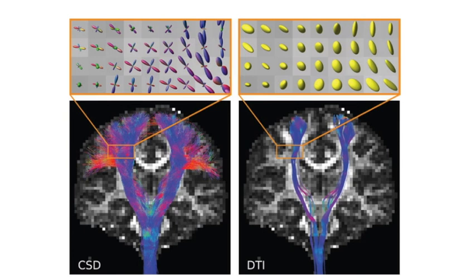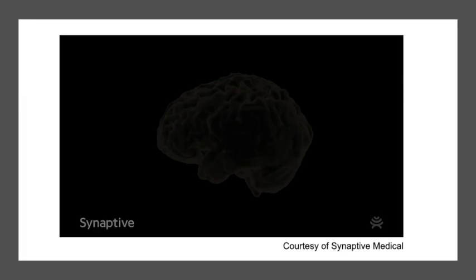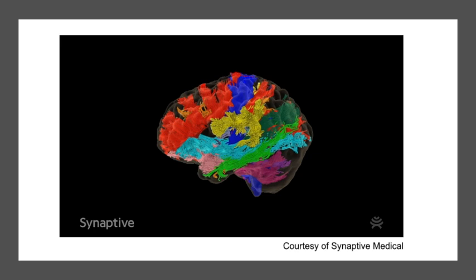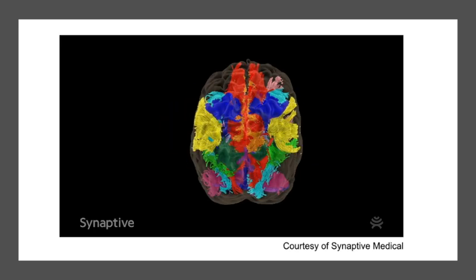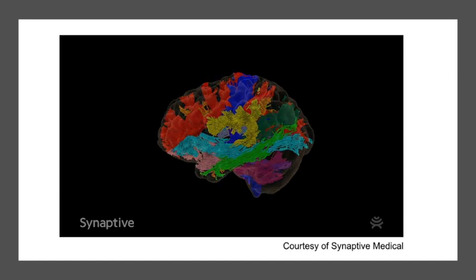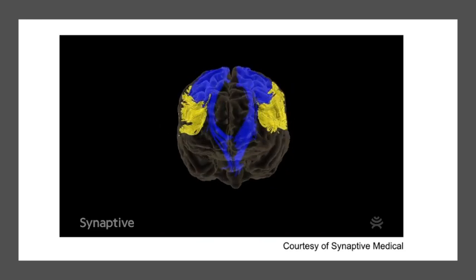From these diffusion tensors, you can group them together in DTI, and these are what we're familiar with, these suspected tracts in the white matter tracts that are in different forms, have different presentations depending on what image modality you're using. Over time, we're now starting to translate these DTI images into three-dimensional tractography, where we can get whole brain tractography, auto segment into specific white matter tracts. And not only that, we can isolate one or two or a group of white matter tracts to further evaluate what those white matter tracts are doing.